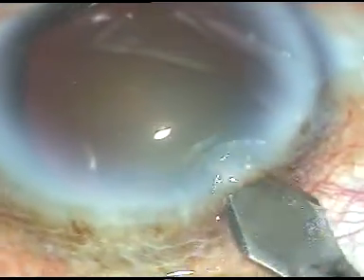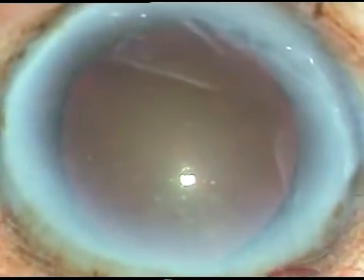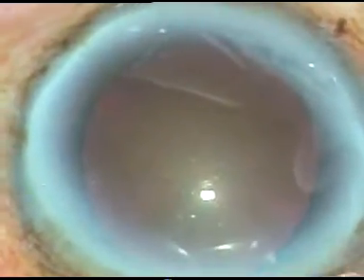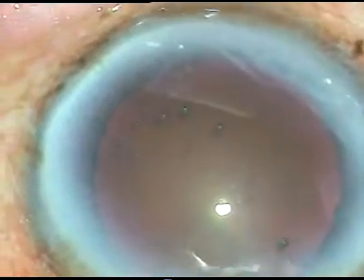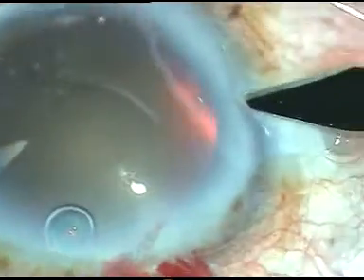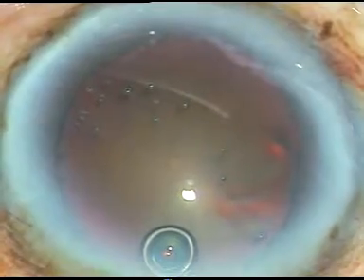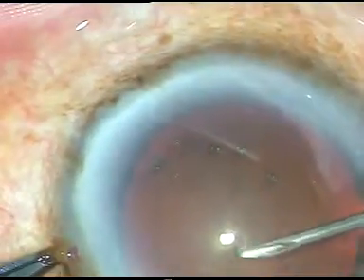Dear colleagues, during phacoemulsification, sometimes the pupillary margin of the iris can get caught in the aspirating port of the tip of the phaco handpiece. In this case, the same thing happened and let us see how I managed the rest of the surgery.